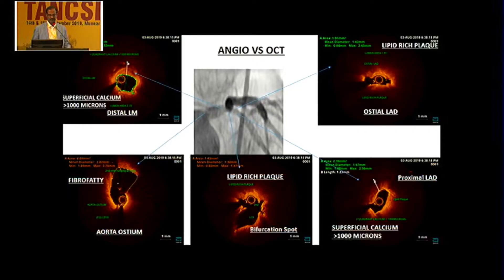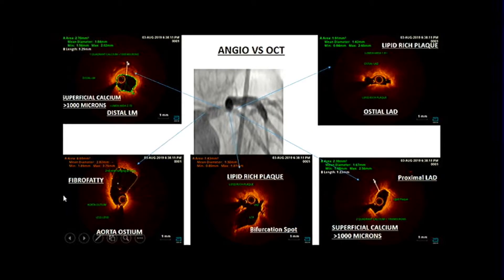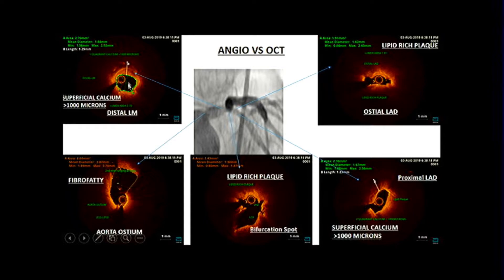With these measurements, the ostio left main shows a fibro-fatty plaque, while the distal left main has calcium at less than 180 degrees. There are more lipid-rich plaques in the LAD, and the bifurcation and proximal LAD are also calcific. The minimal lumen area was 2.7 mm² in the distal left main, which is a very critical lesion.